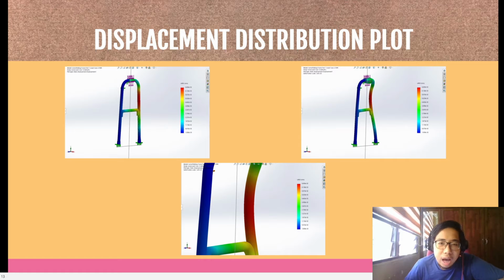As you can see, I will explain about the displacement distribution plot for case 1, that is stand up. The two pictures above are the before and after deformation for one side of the walking frame. As you can see, we put 3 fixture points for our model, 2 on both legs and 1 on the joint between the front handle and the walking frame.